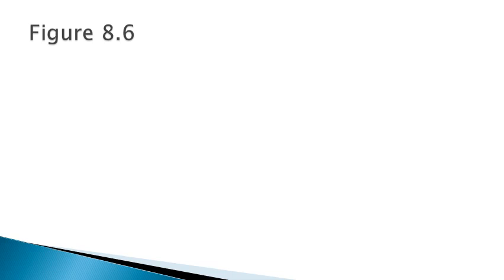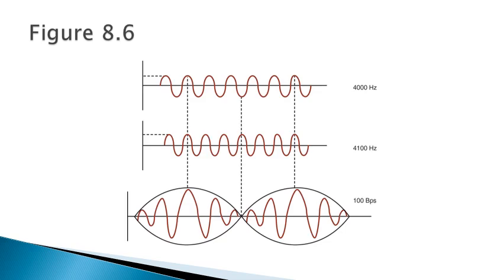Okay, so picking up where we left off. This is a picture, it's in your textbook as well. It's representative of an interferential current. As we said, with interferential, you're using two channels, and the two channels kind of superimpose on one another. They create what's called a constructive interference effect.